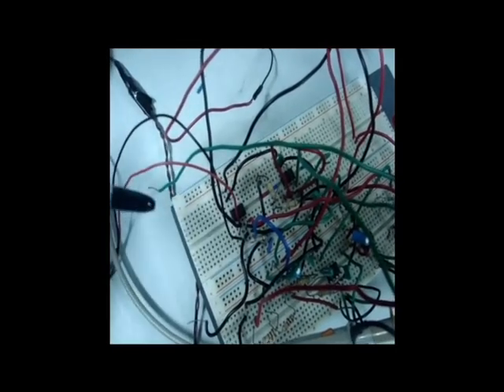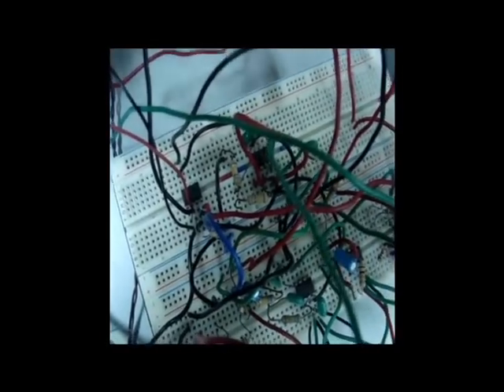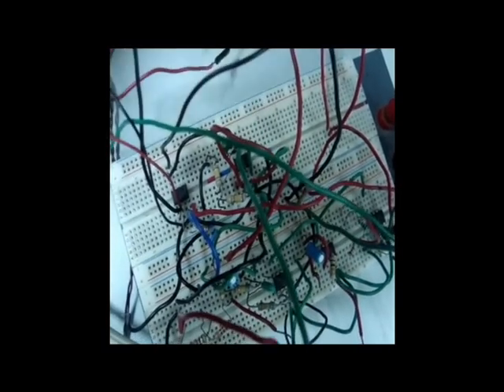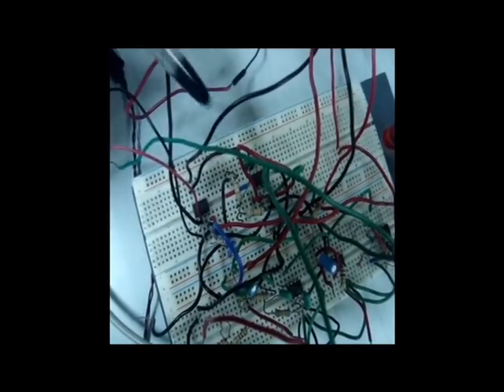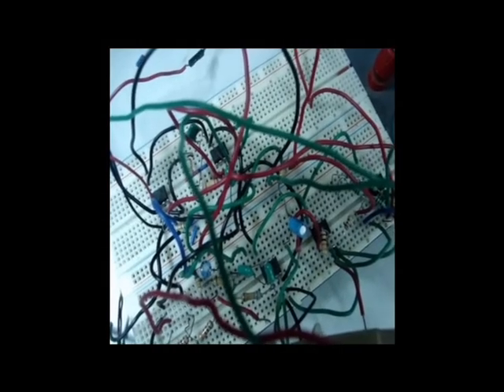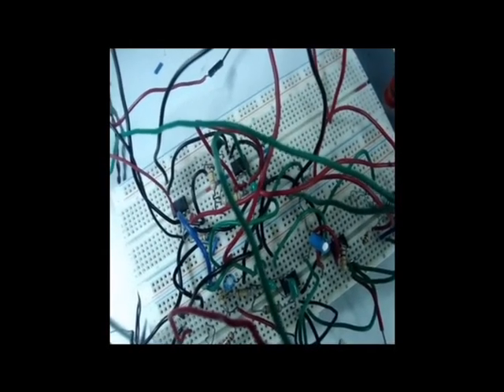The output of the transimpedance amplifier is fed into a unity gain active second order Butterworth low pass filter. This offers an attenuation of 40 dB at 50 Hz. This eliminates most of the noise due to ambient light. The output of the second order low pass filter is a PPG waveform which has a very small AC signal of around 8 to 10 millivolts plus some DC offset.